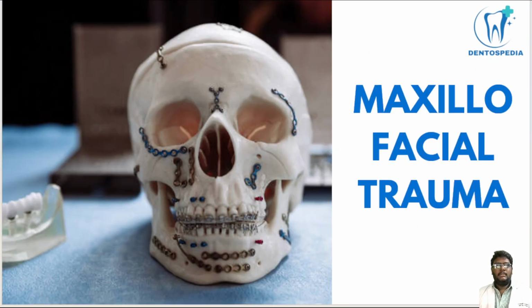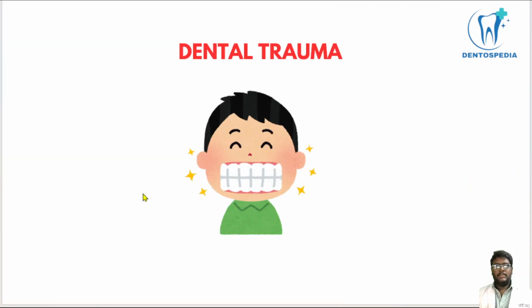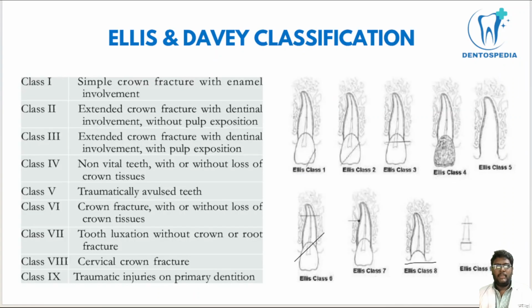Today our topic is about maxillofacial trauma. We are going to deal with dental trauma and facial skeleton trauma. And the first one, that is dental trauma. We have an important classification, that is Ellis-Davey classification.